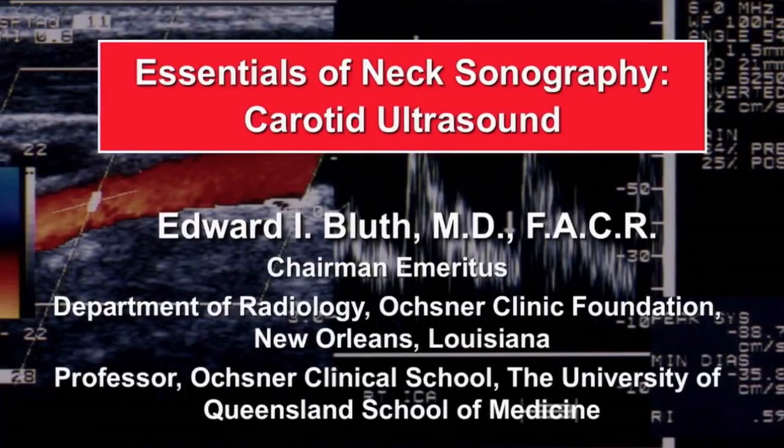I'm Ed Bluth, and I'm going to be talking first about carotid ultrasound, followed by a talk by Dr. Shweta Bhatt on the thyroid, followed by a talk by William Wan on the salivary glands. So we're introducing color flow Doppler, we're doing thyroid biopsies and thyroid nodules, and an assessment of the salivary glands. So I hope you enjoy it, but we're doing everything that's in the neck. I'm going to be starting first talking about the carotid ultrasound.